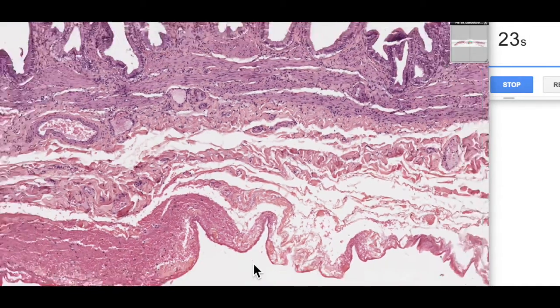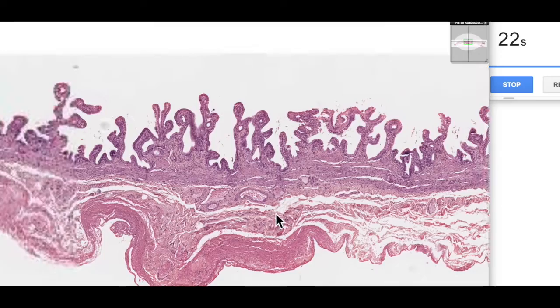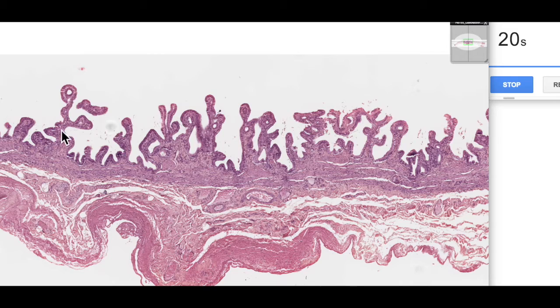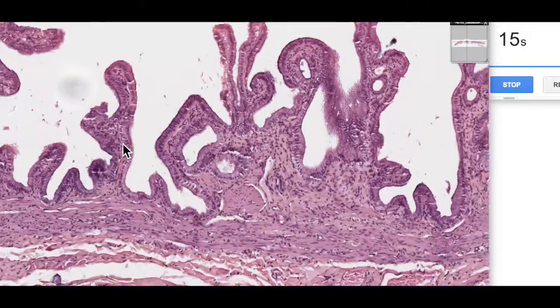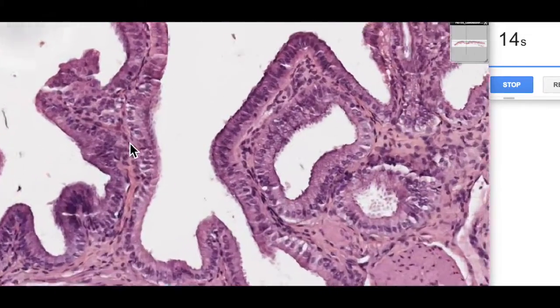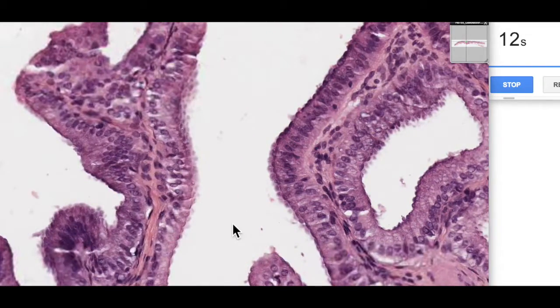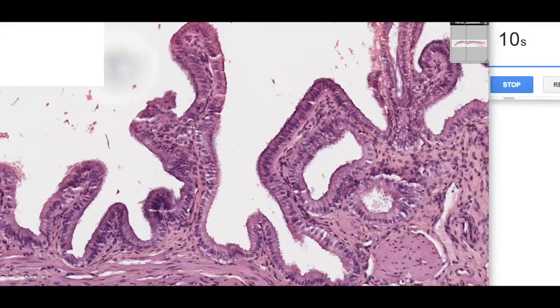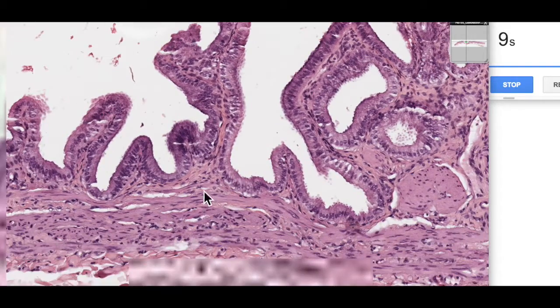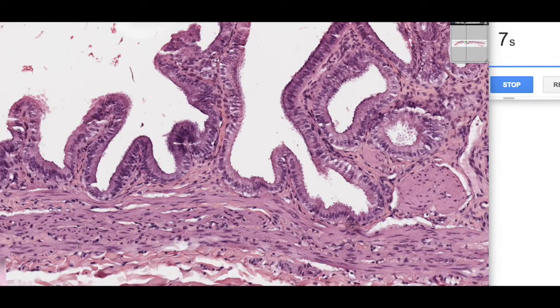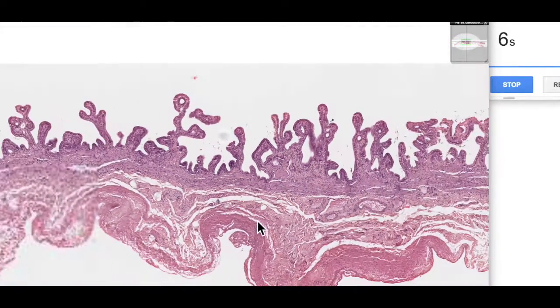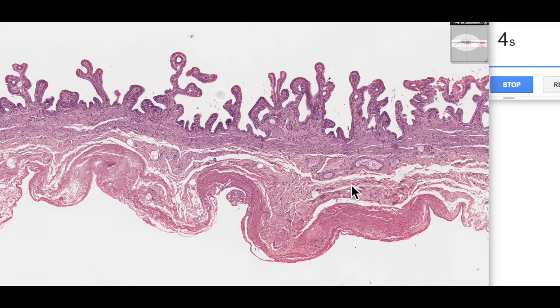So most of the features to distinguish the gallbladder are these strange mucosal projections, a little bit like villi, but looking quite different — no brush border, no goblet cells, no muscularis mucosa, straight into a muscularis, and then an adventitia on the outside. That's a quick overview of the histology of the gallbladder, and I hope you found that useful.